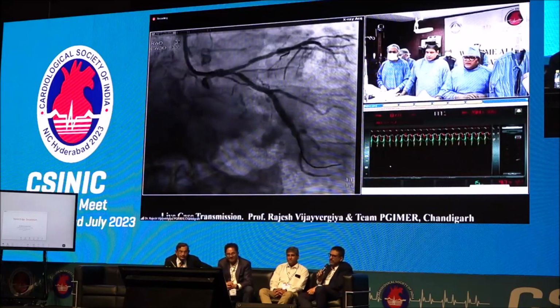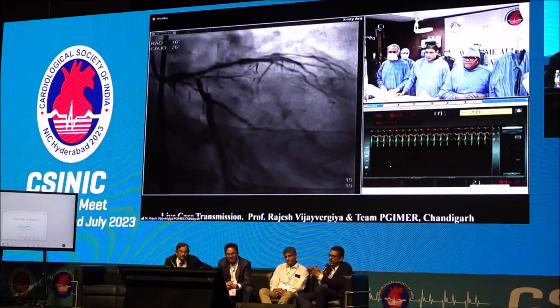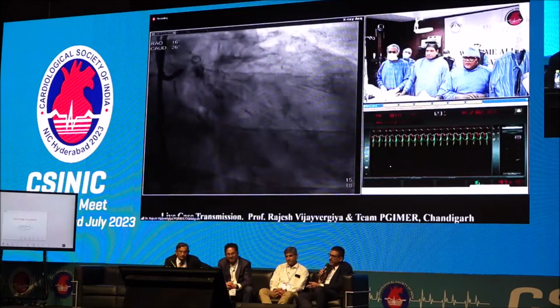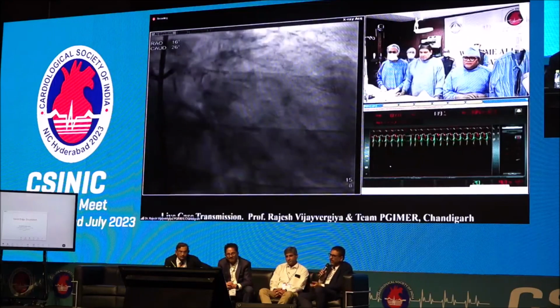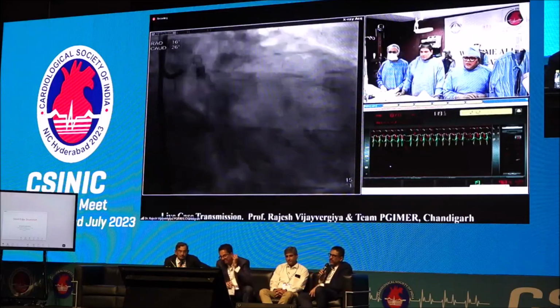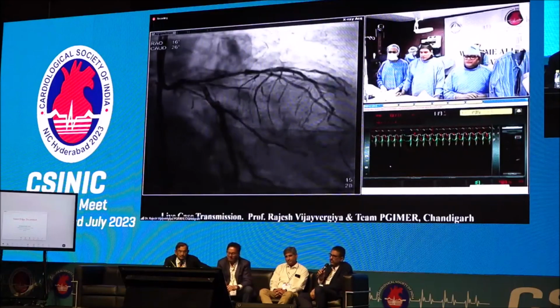I think, Dr. Rajesh, you have a long left main and a LAD lesion which is very long, and the LCX ostium lesion is very focal actually. So I expect that you will do a good job first for the LAD, and then I think we can decide about the upfront strategy for the ostial circumflex. What is your opinion on this?